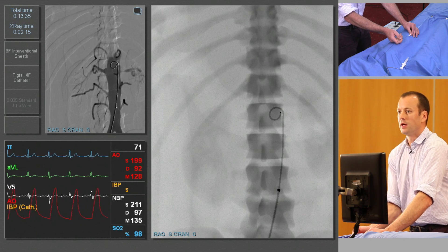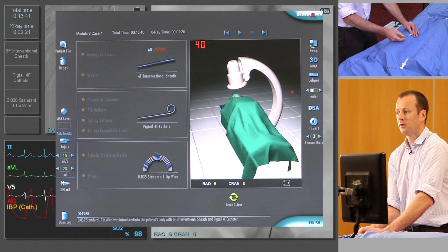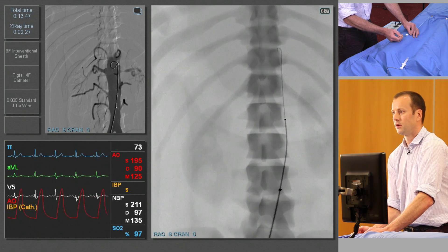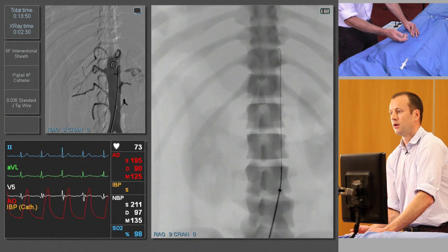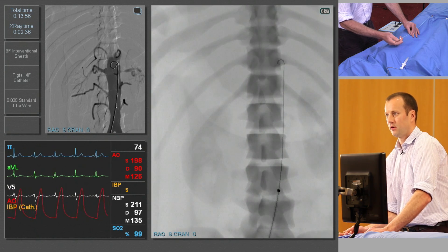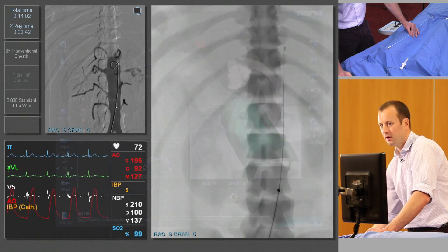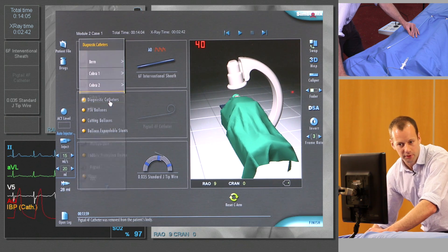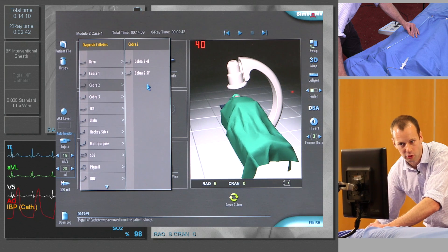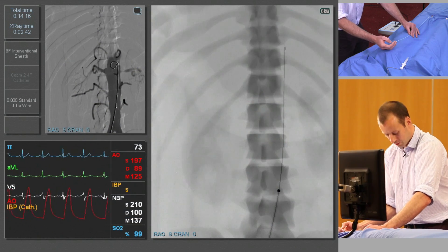At this stage we need to remove the catheter, so we'll re-advance the guide wire into the pigtail and straighten the pigtail catheter out. This is something you generally do with an assistant controlling the sheath. You're aiming to keep the tip of the guide wire in exactly the same position and remove the catheter. We'll now change the catheter for an appropriate shape for selecting the renal artery — something like a Cobra 2 shape in a 4 or 5 French is about right — and then reinsert the catheter.